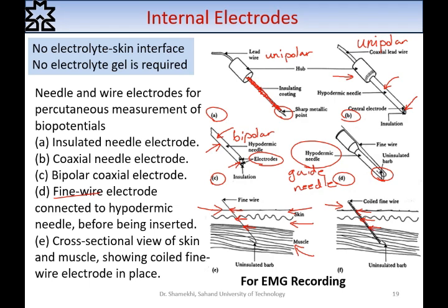This coil shape will help to not be broken. And also these electrodes are commonly used for EMG recording.